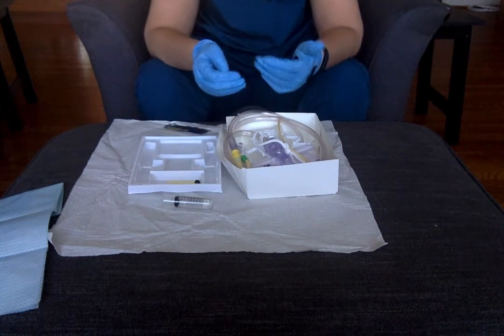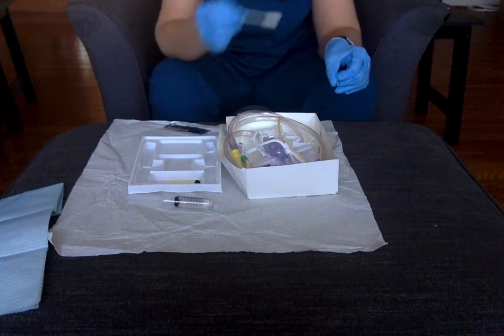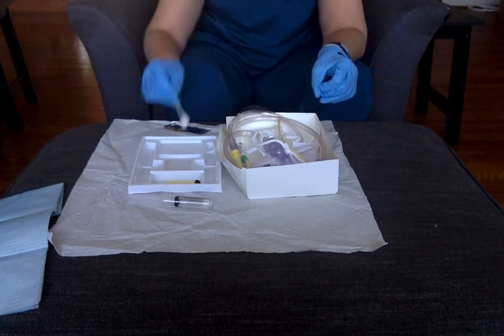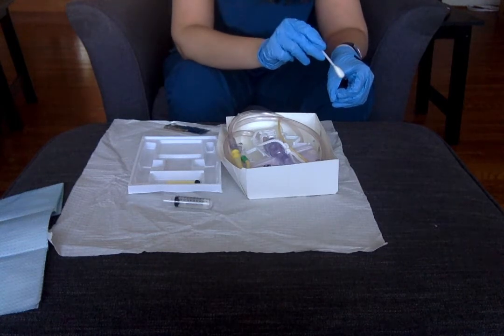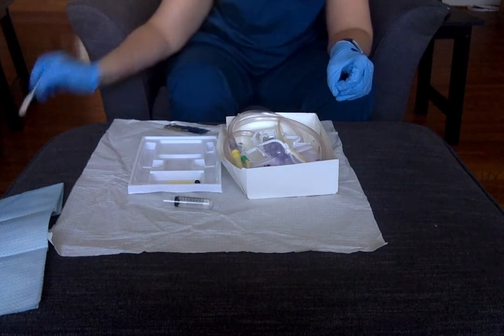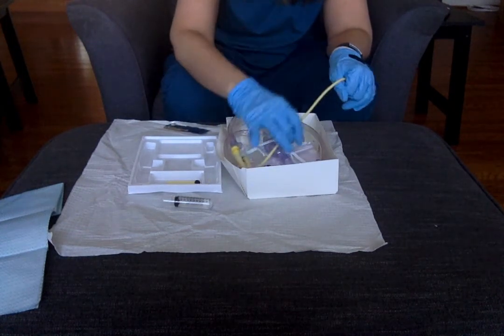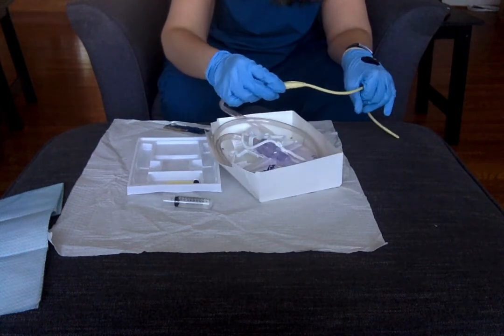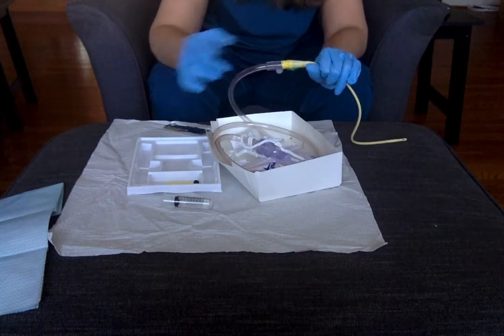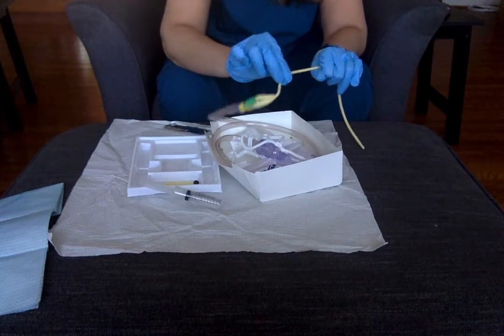The only difference I want to point out for male insertion is that when holding the penis to clean with your three swabs, you're starting at the urethral opening and circling around the glans of the penis — going away, throw it away, pick up the next one and do the exact same thing: start right at the urethral meatus, circle away, and one more. When you go to insert your catheter, dip it into the lubricant and insert. For male patients, when you see urine, keep inserting — you should actually go all the way down to the bifurcation where it splits into your port, then inflate your balloon and tug it back down until it's sitting at the base of the bladder. This is because their urethra is much longer and we don't want to accidentally cause trauma.